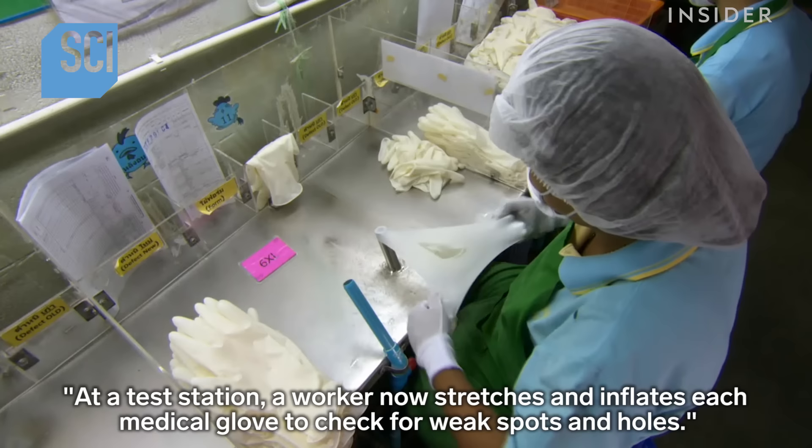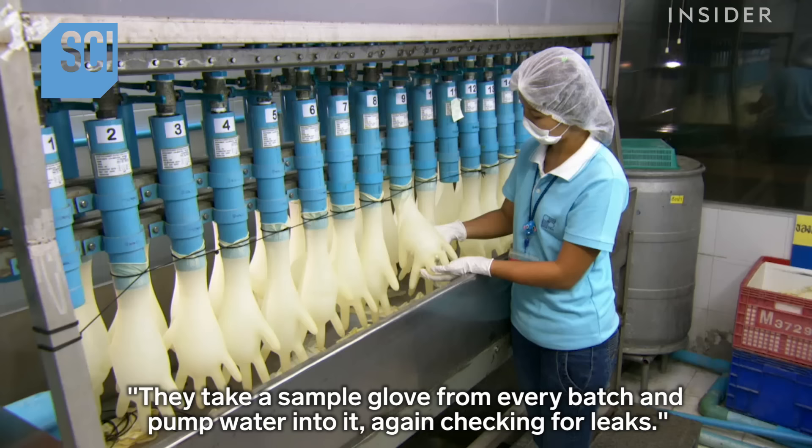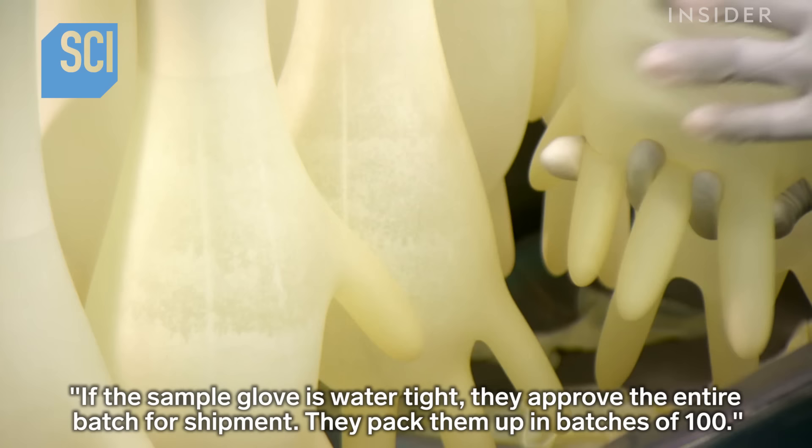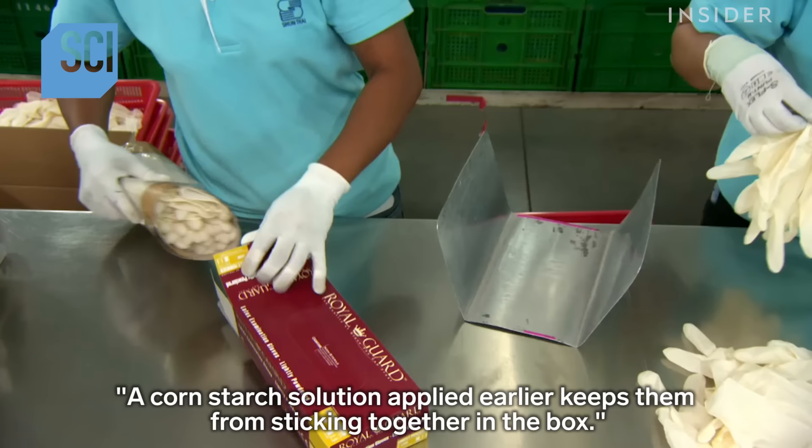At a test station, a worker stretches and inflates each medical glove to check for weak spots and holes. They take a sample glove from every batch and pump water into it, again checking for leaks. If the sample glove is watertight, they approve the entire batch for shipment.